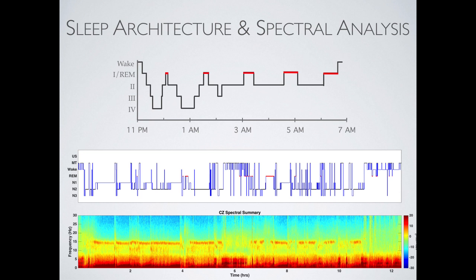I'll just briefly pause on this again, since sleep research is near and dear to my heart. We saw this example, a hypnogram we called it, of depth of sleep: lighter sleep, deep sleep, and the red dreaming sleep. This is an actual example rather than a cartoon of some data I'm working with. One of the things about breaking these things out into the spectral domain is it's a nice way to distill very complex signals into very simple patterns that pop right to the eye. So anyone can look at this and say, there's something going on here that stops right there, and that the brain is doing very different things here versus there, which again you can see mirrored in the hypnogram.